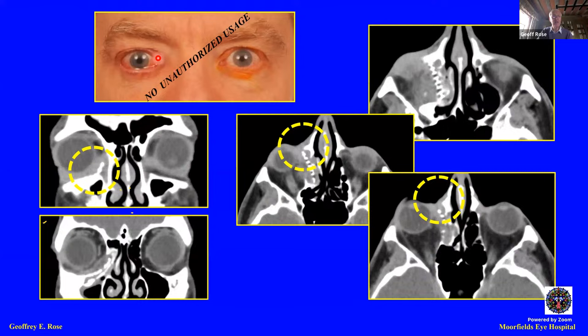Here is another patient referred with a persistently mucky and watery eye, following a repair of an orbital floor fracture. When you look closely, they put in a titanium implant, which not only goes into the lacrimal sac area, you can see the sac on the other side in the upper duct, so they put it actually into the lacrimal sac on that side, but also it goes into the sinuses. Here on the axial, you see the titanium has gone right through the sac and its canaliculi and so on. So it's best to avoid putting it in.